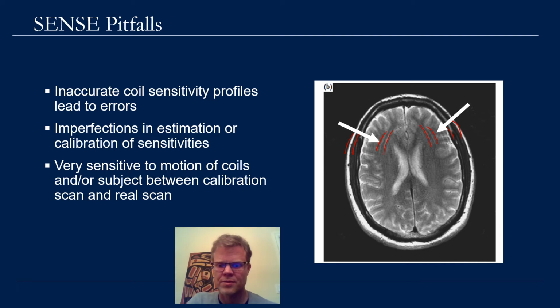It's originating from some other location, but we're unable to remove it. So we have the aliased images. We're trying to go back to these unaliased images here, but let me erase this so you can see the artifacts again. We're unable to remove some of these residual aliasing artifacts, again, due to one of the reasons listed at the left here.